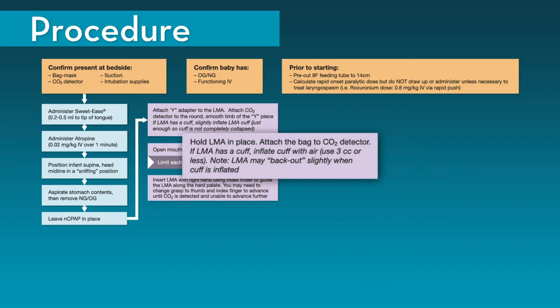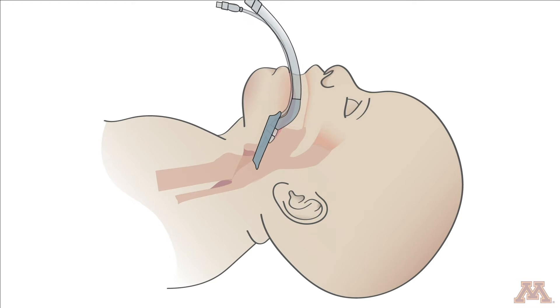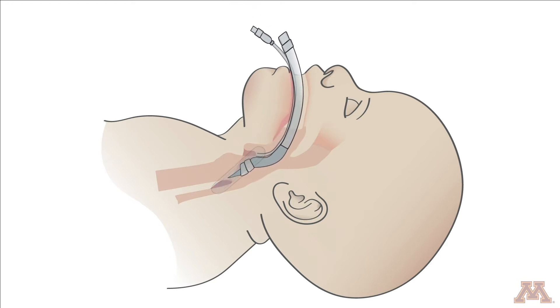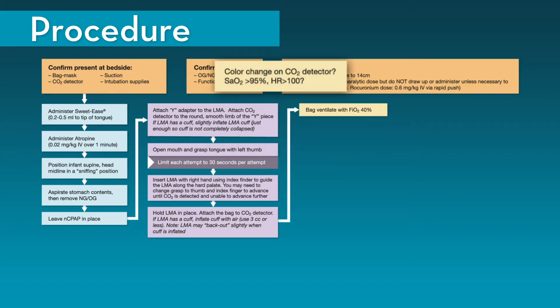Hold the LMA in place and attach the bag to the CO2 detector. If the LMA has a cuff, inflate it with air to the manufacturer's recommendations — this will usually be 3 cc's or less. Once the LMA is in place, bag ventilate with the FiO2 set at 40%. Look for color change: if the CO2 detector turns yellow, this indicates that carbon dioxide is present and the LMA is in good position.